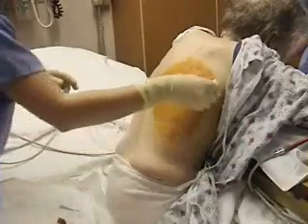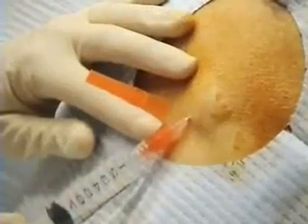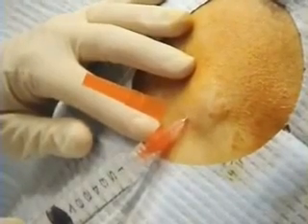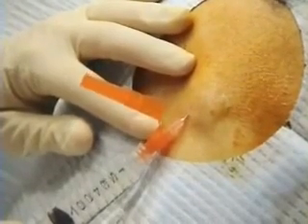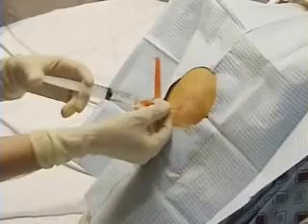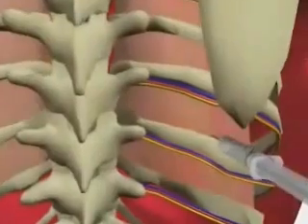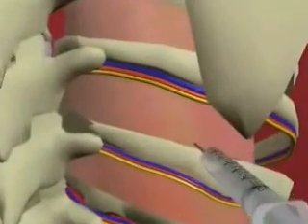Prepare the area with antiseptic solution and apply a sterile drape. Using a 25-gauge needle, place a wheal of local anesthetic such as lidocaine along the superior edge of the rib that lies below the selected intercostal space. Switch to a 22-gauge needle and begin to anesthetize the deeper tissues.